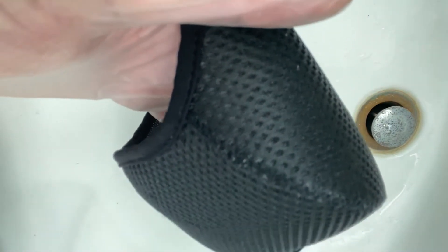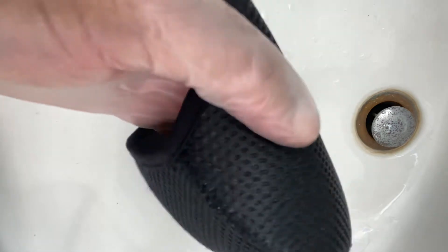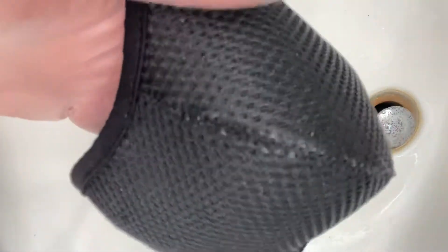Okay, hello. I hope y'all having a great day today. I'm gonna show you how I clean my mask. Now, this is the N95.